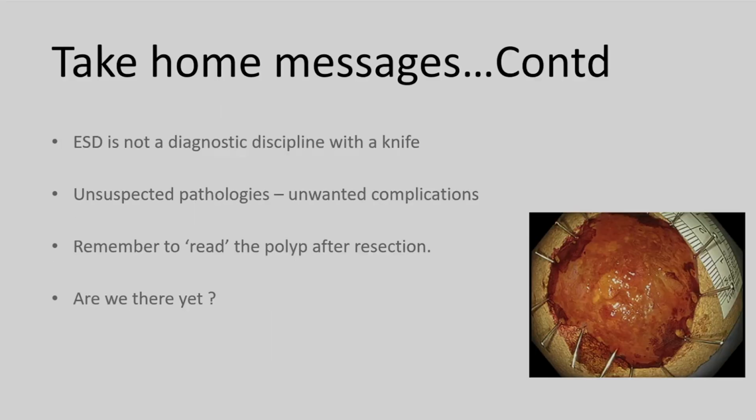So please try and do that. So this is again assessment with the stain after resection. I don't like using Lugol's before you do ESDs, not on the same day because it just constricts and causes problems. But when I've marked out the lesion, I try and remove it, and then I use Lugol's to confirm that I've resected everything. So, ladies and gentlemen, last slide.